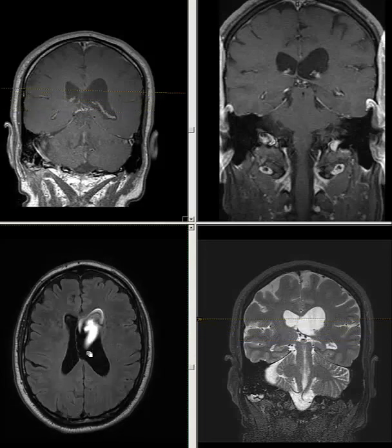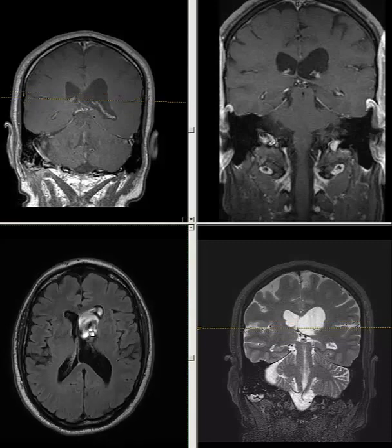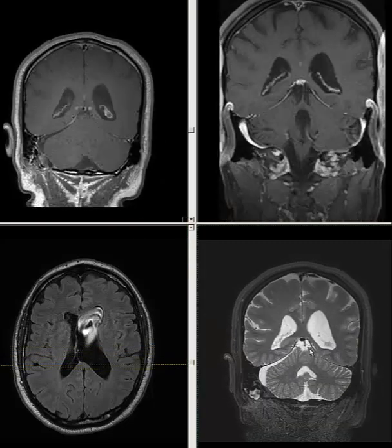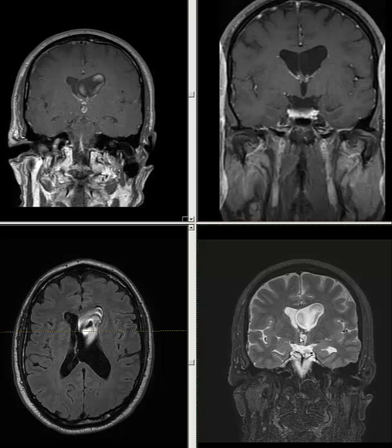And you can also see the jet phenomenon through the left side foramen of Monro into the left lateral ventricle. You can obviously see this jet phenomenon originate from the foramen of Monro because the turbulent flow is kind of a circle around this entry point. Same thing here. You can see the jet is pointing towards the foramen of Monro.